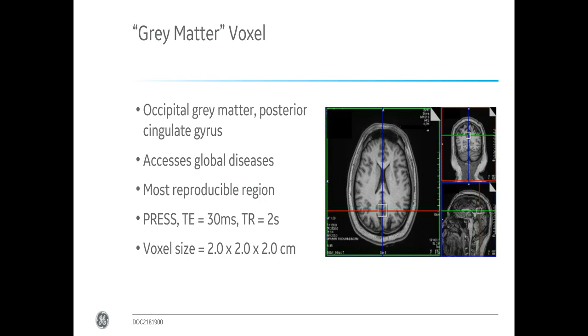because of two reasons. It is very homogeneous in that area, and if you think of patient motion, and in the beginning, when we are even going back to 1.5 Tesla spectroscopy, where acquisition times were longer than today, there was an even higher chance that the patient moves the head. And if you really think of head motion, then it's more from right to left.